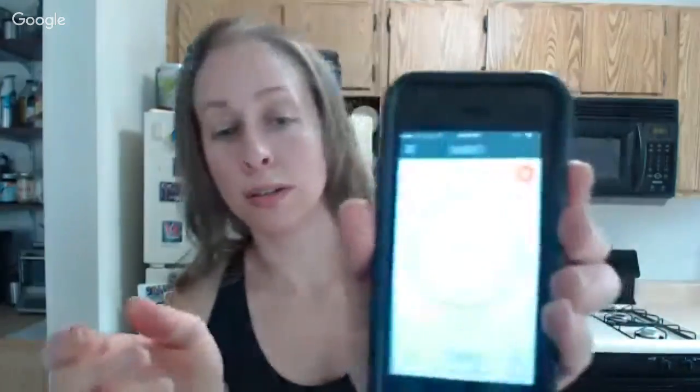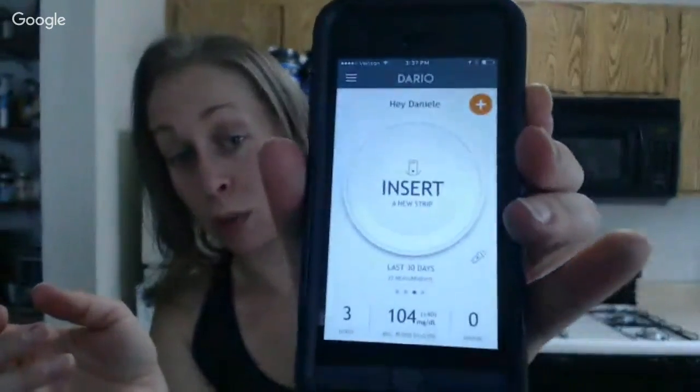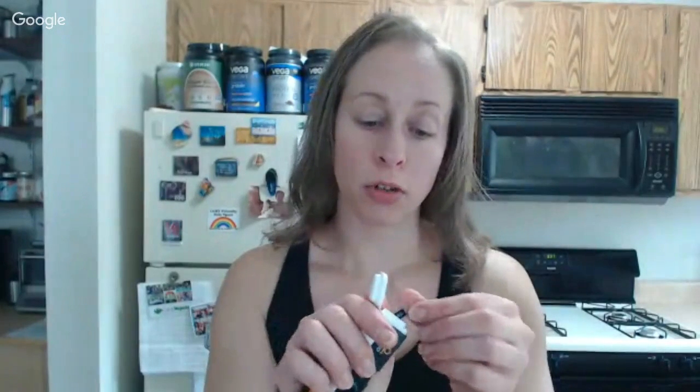Plug the meter right in. Then the screen is saying it's connecting, right? And now it wants me to insert a test strip. So I'm going to grab my test strip from here, open up the vial, click it up, grab a test strip, pretty little gold test strip, and then I'm going to stick it into the meter, which is right there.